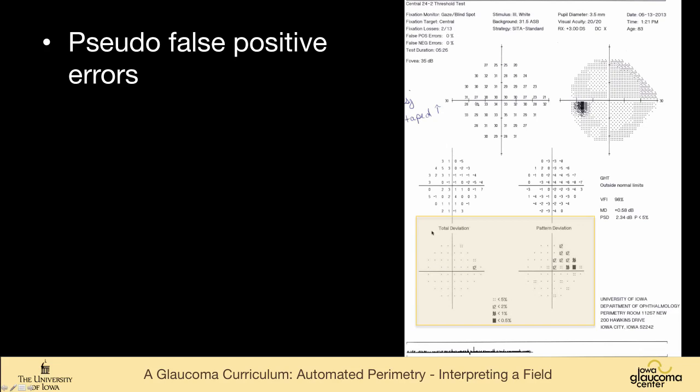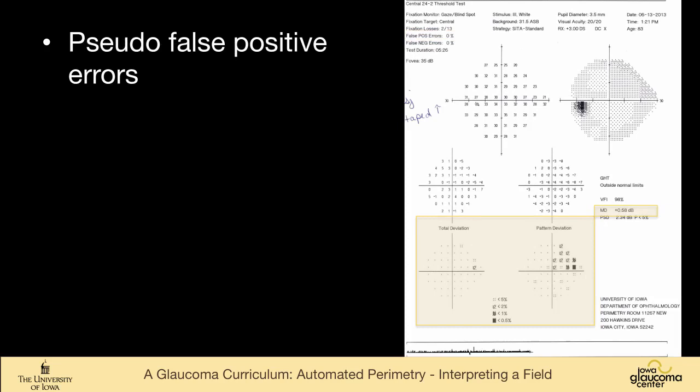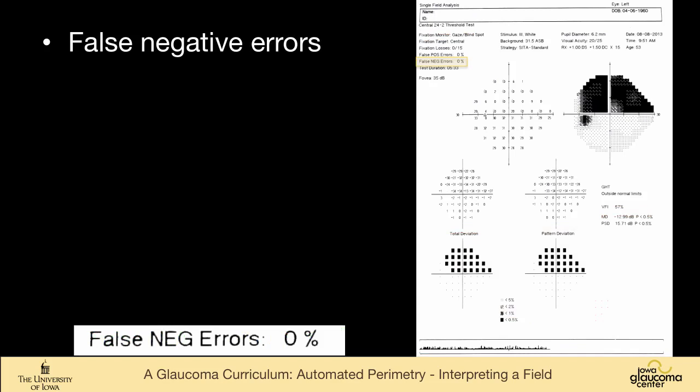And this is an example. There's zero false positives here. Total deviation, a little bit of abnormality, but nothing to write home about, and yet there's this arcuate defect here. Notice how this fits the nerve fiber layer pattern. If we go back to these other fields, not so much. They sort of fit with a random distribution. So this person has a high mean deviation despite having this defect in their superior field, no false positive responses. And obviously, like everything in medicine, you have to correlate it with everything else. So this person does have some thinning in the retinal nerve fiber layer, and this is a true visual field defect.